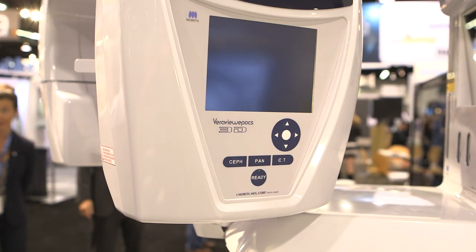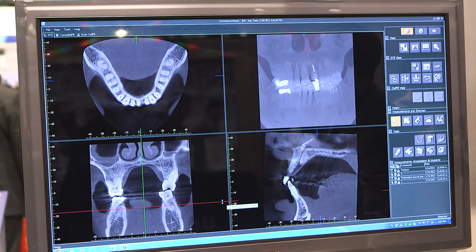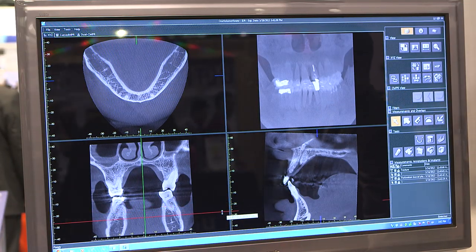One of the really unique features of this machine is the largest two fields of view. The 10x8 and 10x5, as opposed to your traditional cylinder of data that's acquired in cone beam, are acquired in a rouleau triangle, which is more the shape of a dental arch — so we reduce the exposure to the patient.